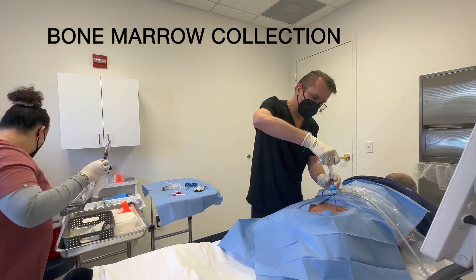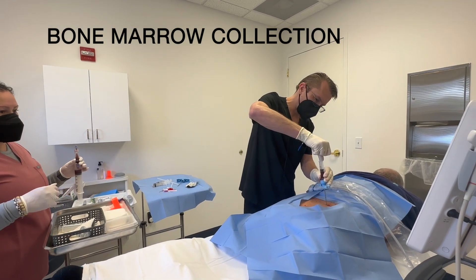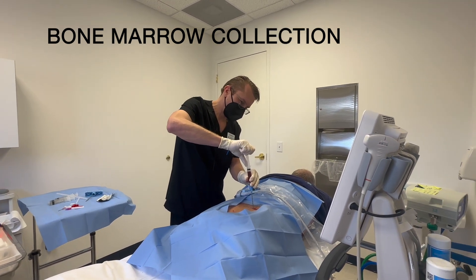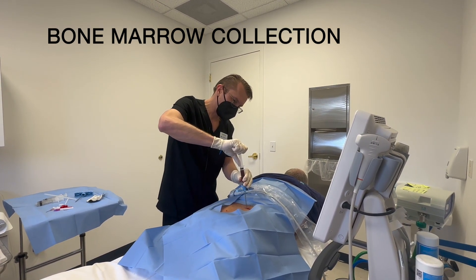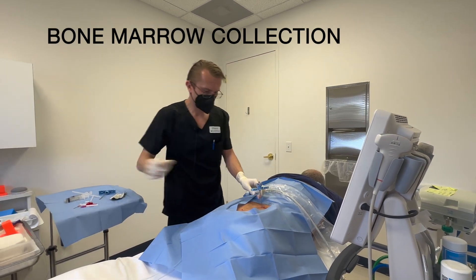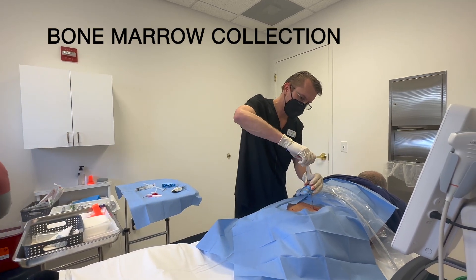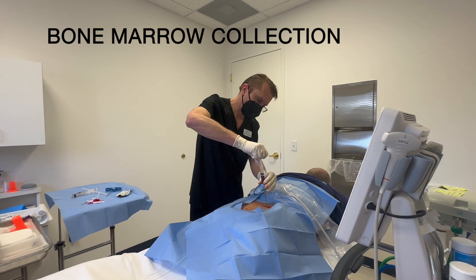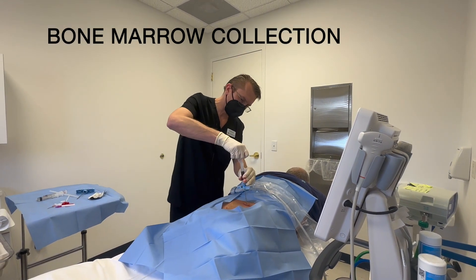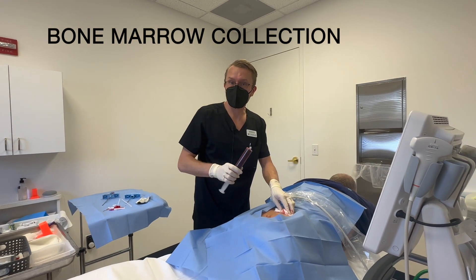So now that the trochar is in, I'm going to go ahead and pull out some of the bone marrow. You can see it flowing nicely into the syringe. Mark, you're going to feel a little bit of pressure. You can see it's filling my syringe very nicely. Mark is going to feel just a little bit of pressure in his pelvis. So we are done with the bone marrow aspiration.